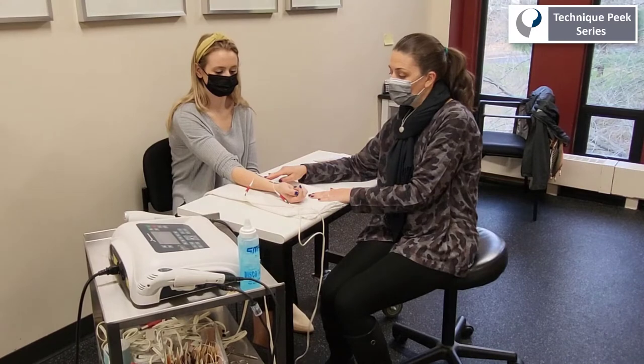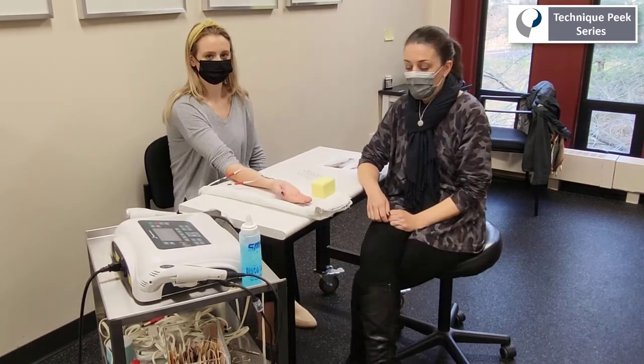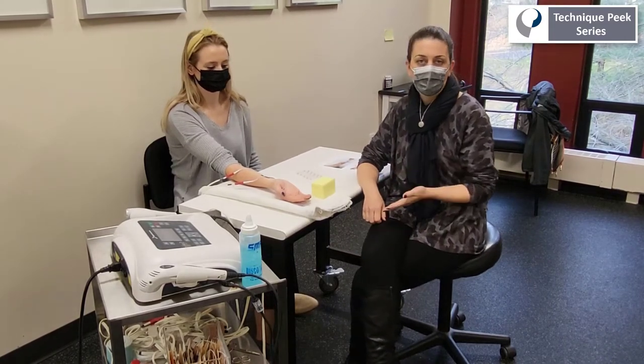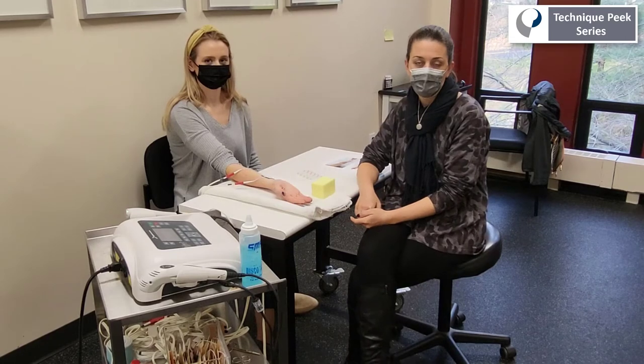Once we've found this target muscle, it's important to combine NMES with functional movement. This is going to maximize the amount of cortical stimulation we're providing to achieve our goal of increasing strength and finger flexion.